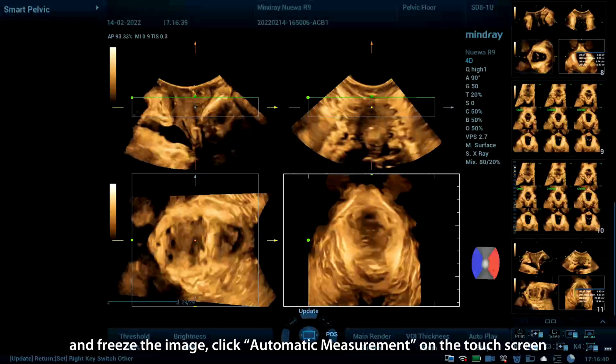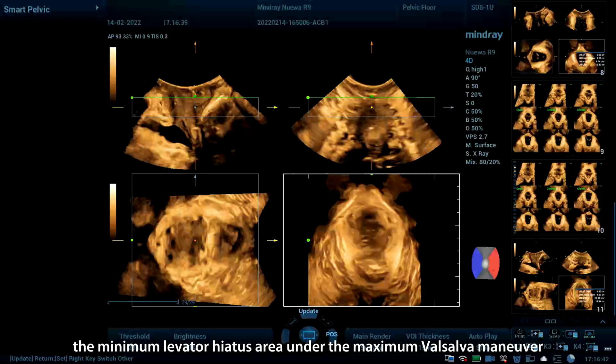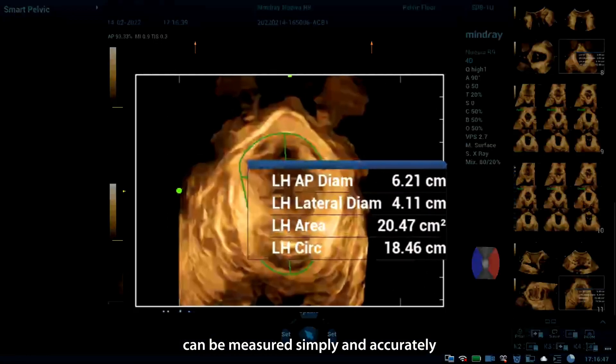Click Automatic Measurement on the touchscreen. The minimum levator hiatus area under the maximum Valsalva maneuver can be measured simply and accurately.